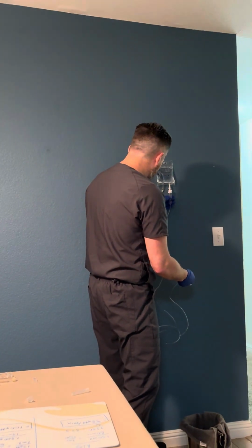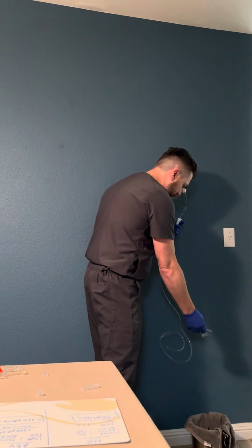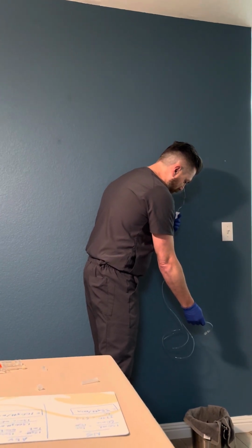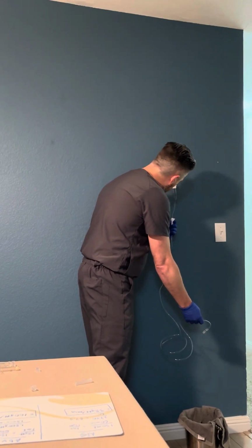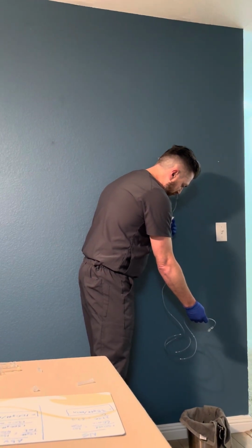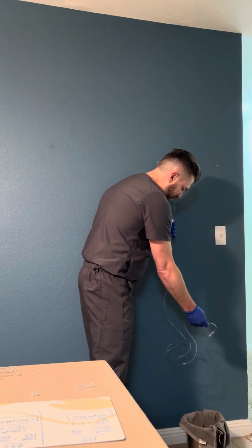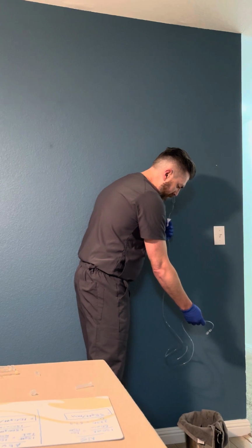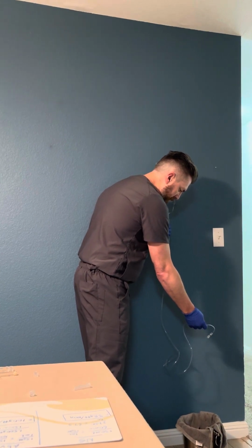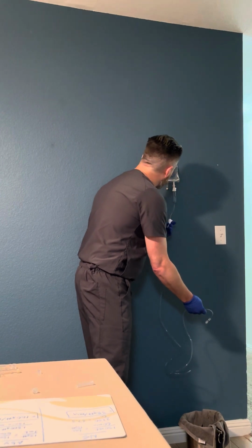Want to fill it about halfway into the drip chamber. And I'm going to open this up to get the air out of the line. We drip in our trash can right here. You don't want to do it too fast, or you can get more air bubbles. It's not going at all. There we go. All right. The line is primed.